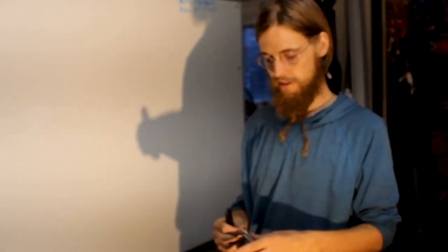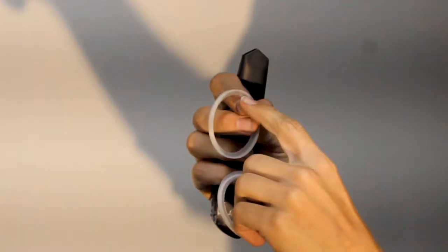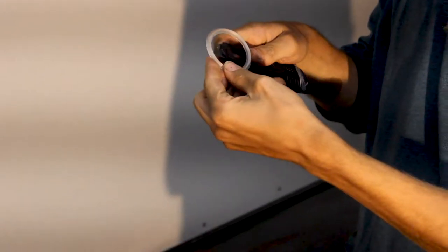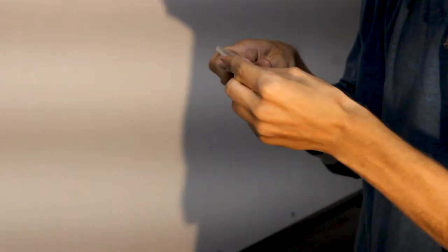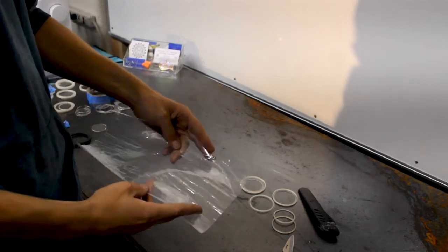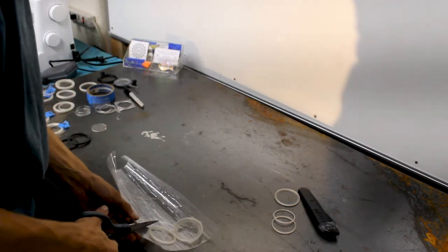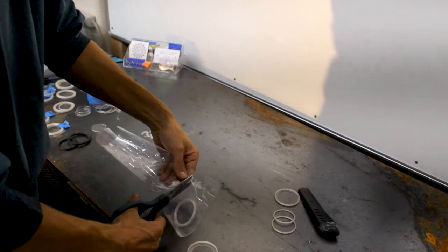Some of the parts need a little bit of cleanup. Namely, these two have some little frayed bits, and that might just be my printer over-extruding on the first layer. So I'm going to clean those up real quick. Alright, now I'm going to cut myself some of the silicone. And I'm leaving a bit of excess because as it squishes in, it's gonna squish some up from the sides.